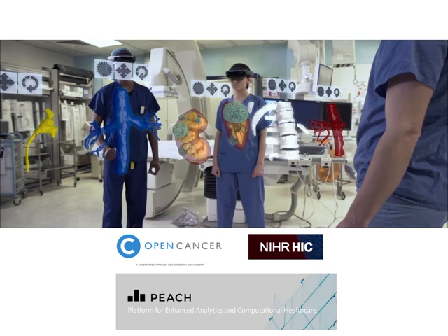And I think it's going to be very difficult to get past that in the kidney, mainly because of the heterogeneity of the tumours, not just the different types, but also within a lesion, you can get heterogeneous lesions. So you can get hybrid tumours of oncocytomas and RCC, and you can also get different aggressions and different grades within a certain tumour. So I think it's very hard to get past that with imaging alone.